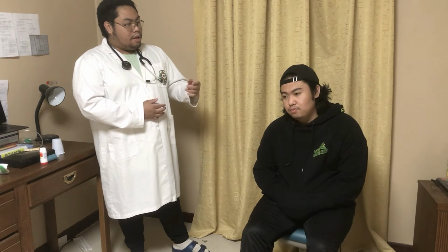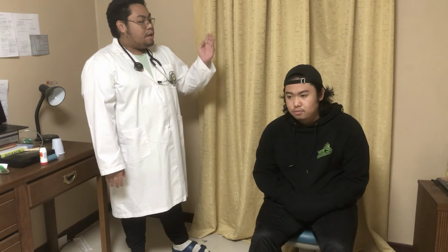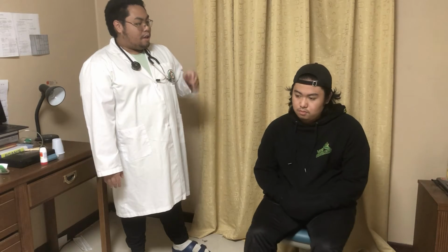Before doing so, just like before, explain to the patient, code drill and start. So, Mr. Ryaan, we're going to be doing your SVC test today. Just like the one before, 3 normal breathings. And then now, we're going to exhale maximally, and then inhale maximally. Exhale maximally, and then inhale maximally.